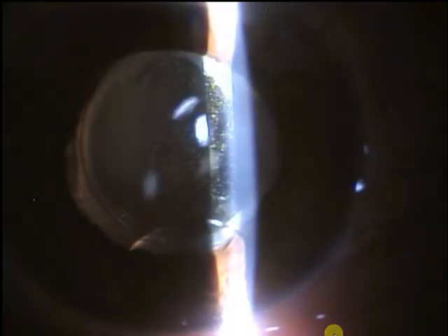It is a very shallow anterior chamber, and you can see this is a perfluorocarbon liquid over here, a bubble of perfluorocarbon floating over here, and I'll stop the video in between and show you that perfluorocarbon. So now we're seeing multiple things in this patient. What surgery has he had? Let's guess. And this is the perfluorocarbon you see, and we're trying to look at the retina of this patient as well now and see what we see inside.